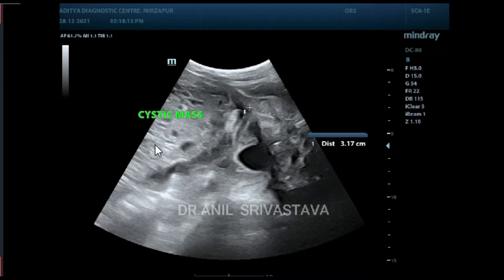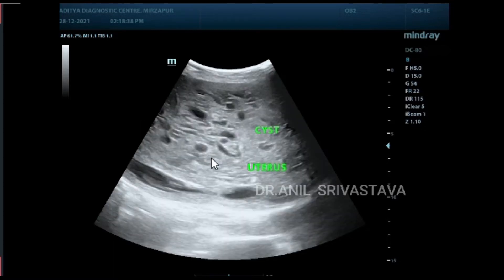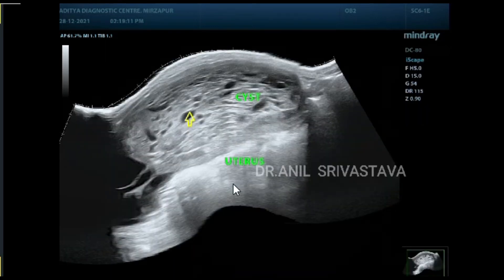This is the uterus, this is the cervix — you can see the cervix. The uterus is enlarged with multiple small cystic spaces in it. The beta-hCG was positive. These multiple small cystic spaces are completely filling the entire uterus.